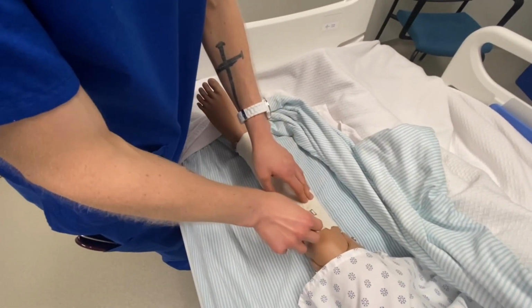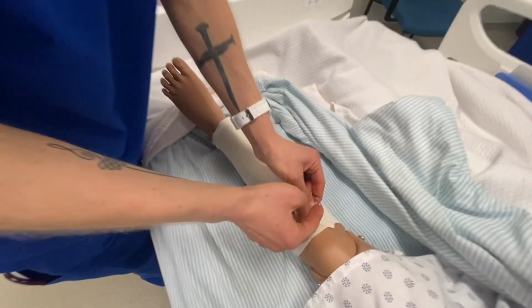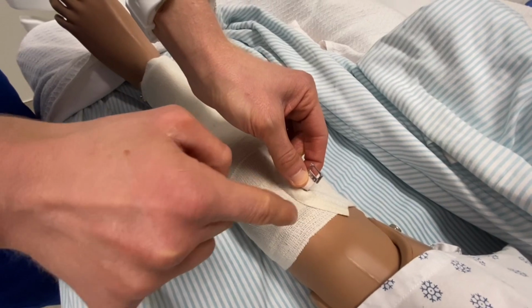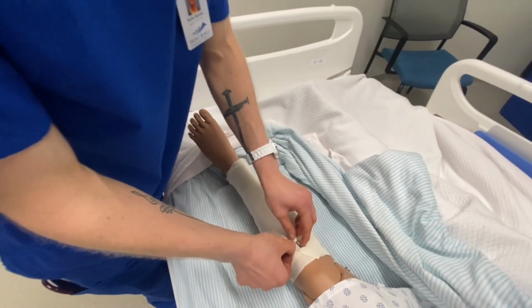which this actually is a risk for injury both to you and the patient because it has these teeth on here that easily poke through and can poke the patient or yourself. So you want to be extra careful if you're going to have to use this.